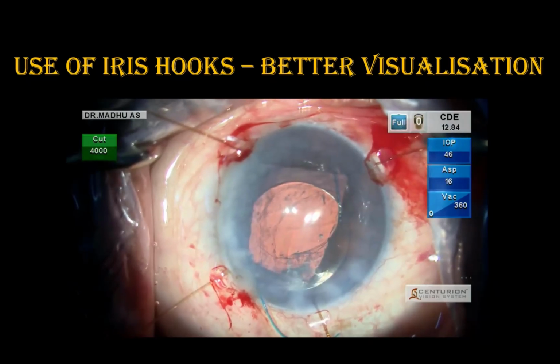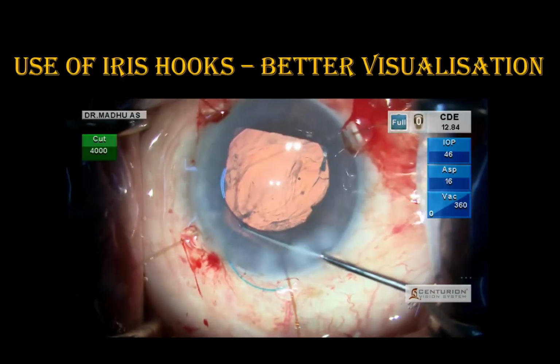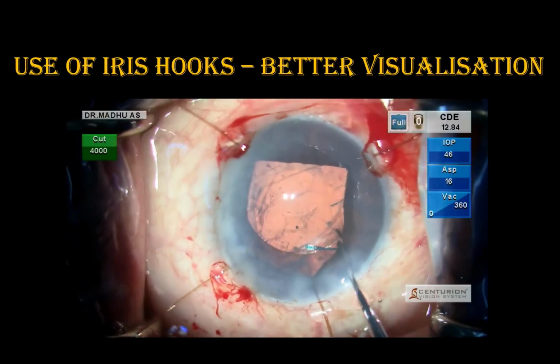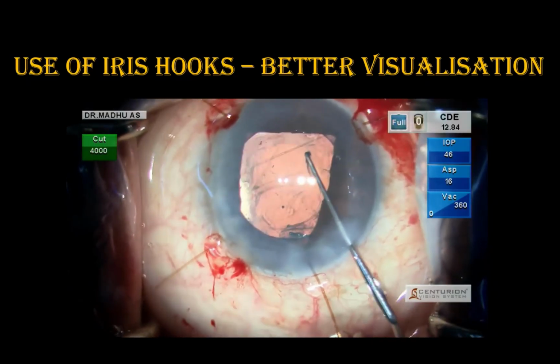So if you blindly place your IOL, sometimes you may land up in IOL drop also. So first you use Iris hooks to retract and see how you can easily visualize the good sulcus support. Then you can safely place a three-piece IOL in the sulcus.